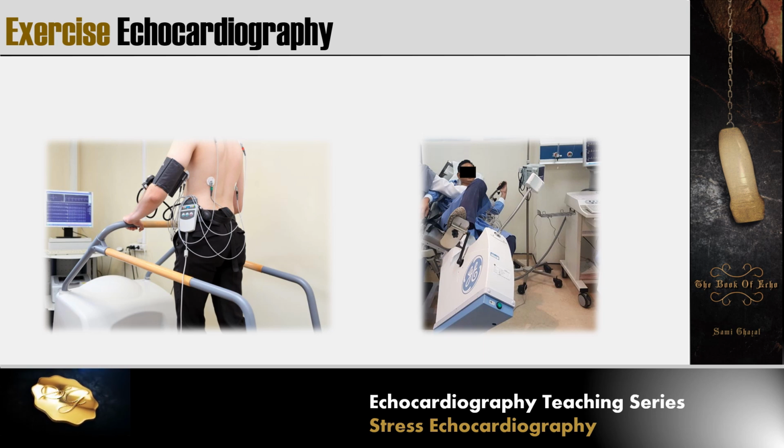Treadmill exercise is widely used, and it has much more clinical experience than the bicycle. Treadmill exercise usually has a higher rise in heart rate, longer exercise duration, and maximum workload as compared to the bicycle. The main disadvantage of the treadmill, however, is you have a limited scanning time of 1 to 2 minutes post-exercise with limited images obtained. So we will take only the relevant imaging, mainly for ischemia or whatever the indication is. We use Bruce or modified Bruce.